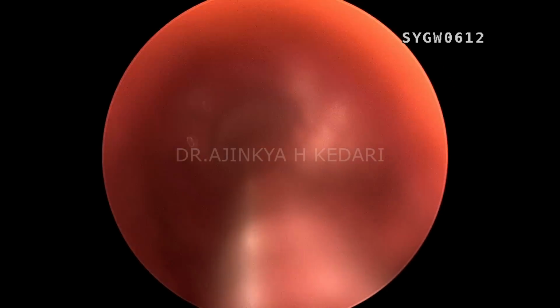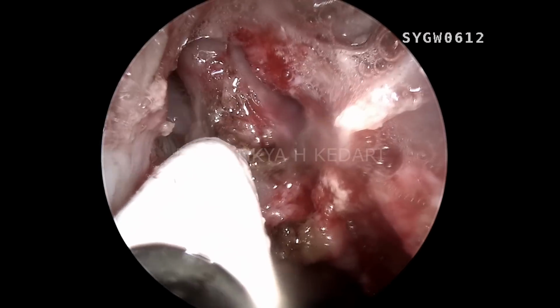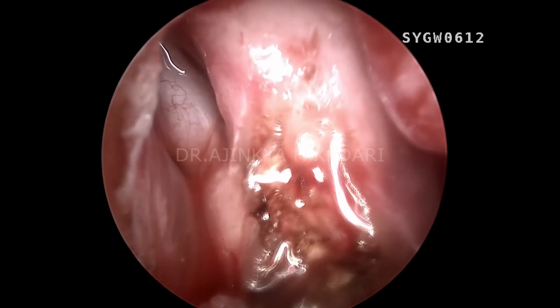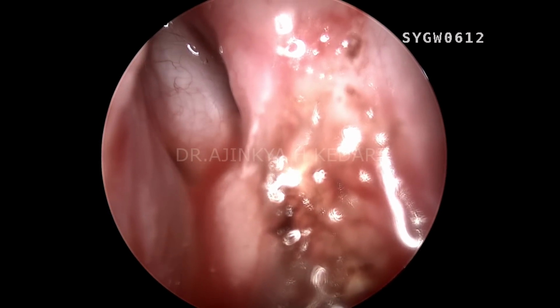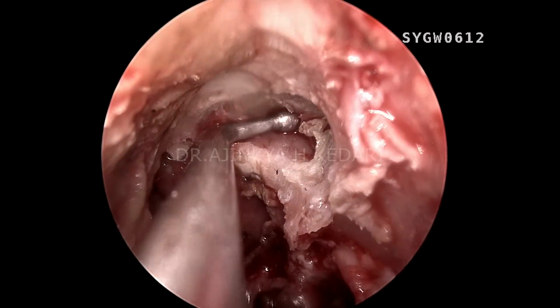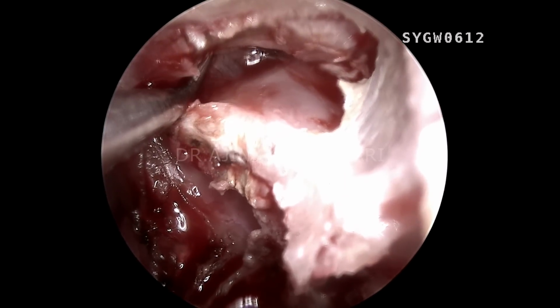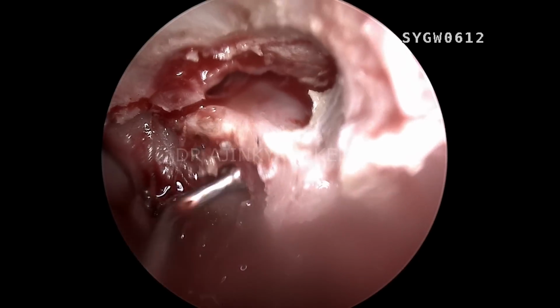Where I'm drilling right now is almost towards the center of the frontal beak. You can see I'm giving thorough washes to remove all that bony debris. You can see the actual high flow CSF from the defect, which is much more visible right now head on. You can see the flow of the CSF. Now, going further superiorly, you can see I'm using a ball probe, and I'm trying to palpate the anatomy of the area. Where I am right now is basically the frontal sinus.